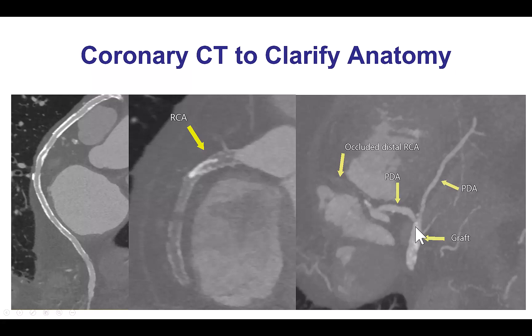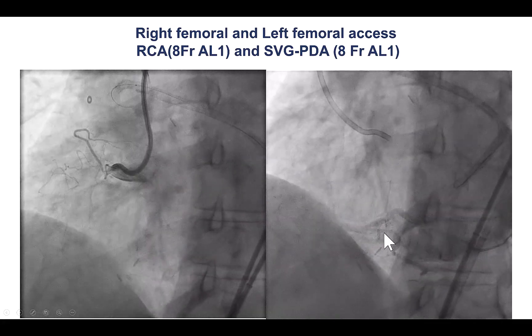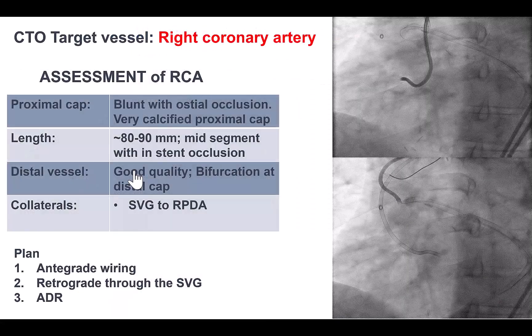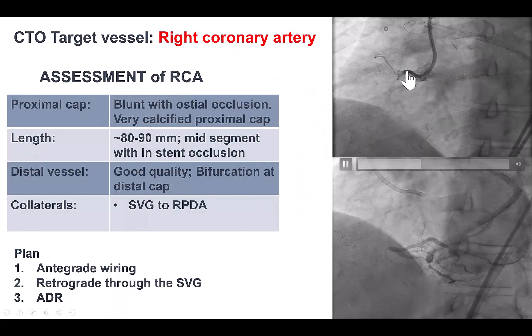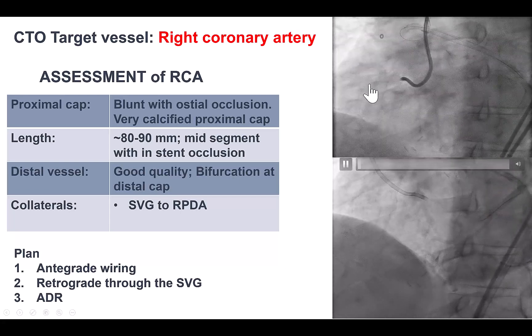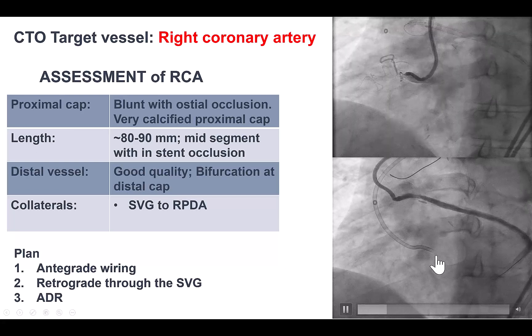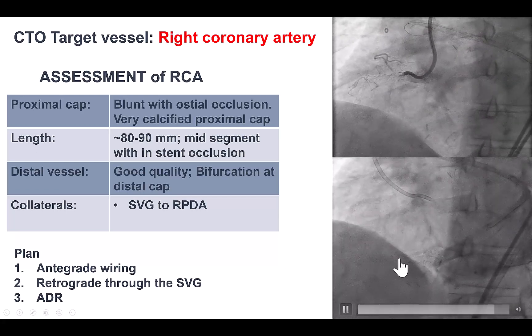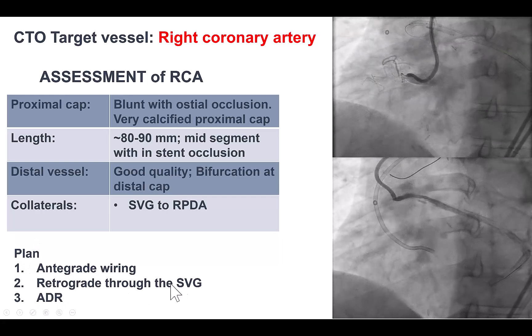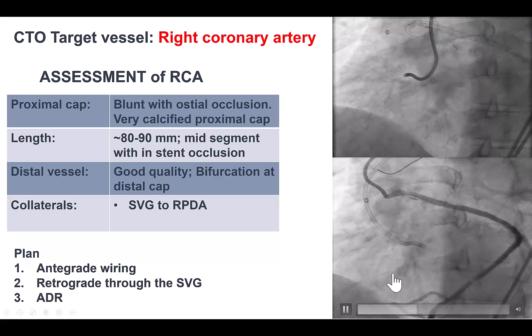There is the PDA that was supplied by the saphenous vein graft. A decision was made to proceed with PCI attempt. We engaged the right with an AL1 guide and the left with another AL1 guide, and decided to perform antegrade wire escalation as a first step because we did have some ostial segment of the RCA that was patent. The distal vessel was of good quality and large, but there was a bifurcation on the distal cap. We also had potential for retrograde through the saphenous vein graft. The first choice for crossing was antegrade wiring, followed by retrograde through the saphenous vein graft, or as a third option, ADR — the least preferred approach because of the bifurcation at the distal cap.